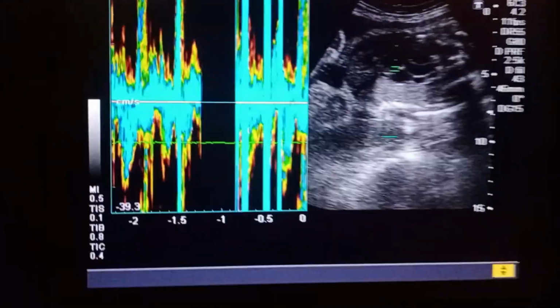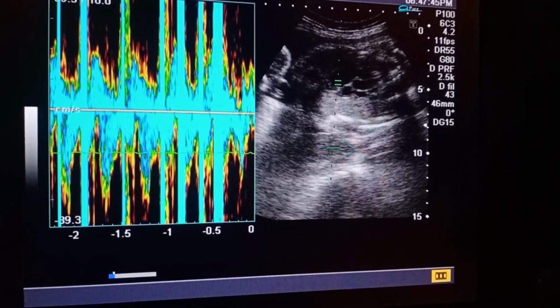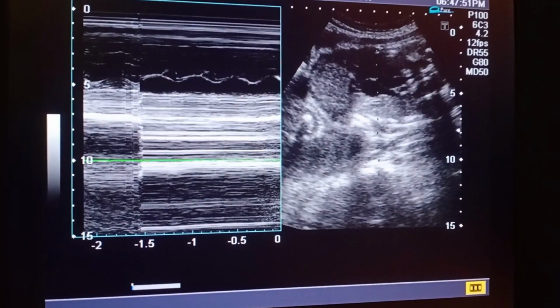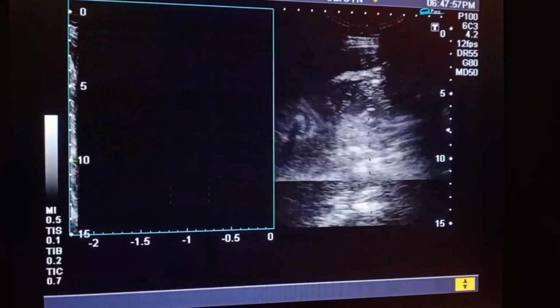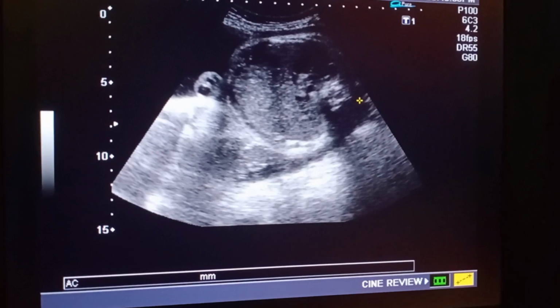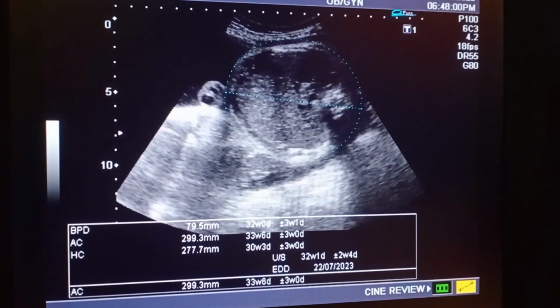Now, this is the fetal heart. You can appreciate it. And now I would like to calculate the heart rate as well. See, this is the heart rate of the fetus. Now this is the abdomen, and I would like to calculate the circumference of the abdomen, that is AC. You can see it.